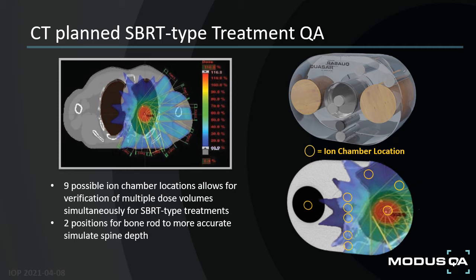By taking that into consideration, this will allow the user to select a more appropriate spine depth that will best fit the given treatment plan, and thus better depict adverse radiation exposure to the spinal cord, and conversely, potentially improve patient outcomes.